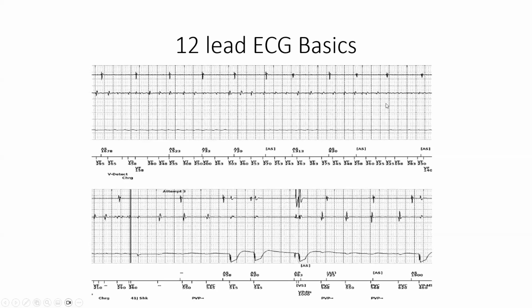There's some time it takes for the device to redetect. It charges again. And then here he does end up breaking. So V-sense, PVC. But anyway, he is mostly back. He is having some PVCs, but he's back in a normal rhythm.